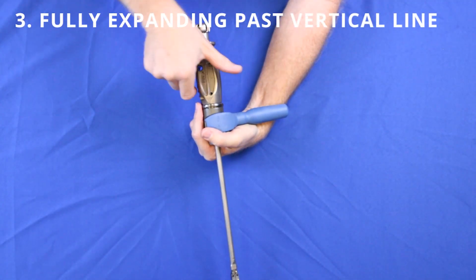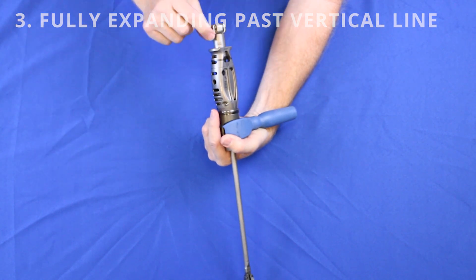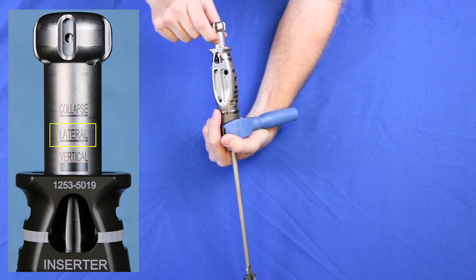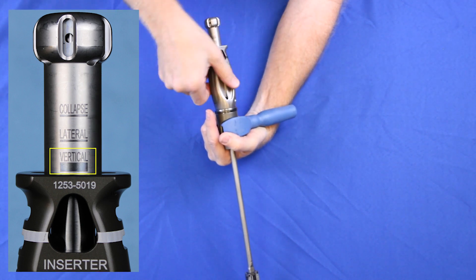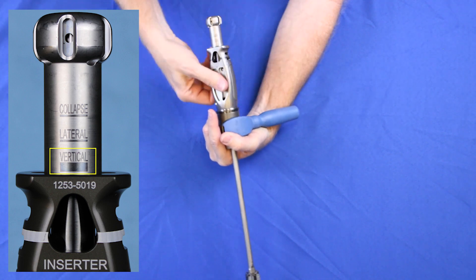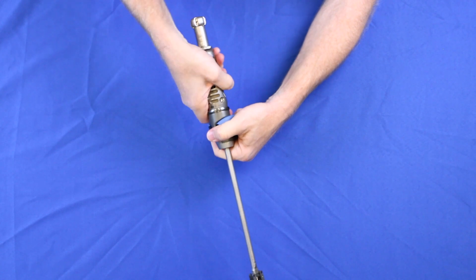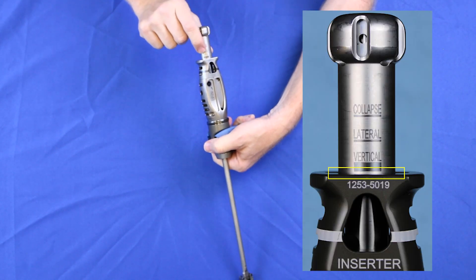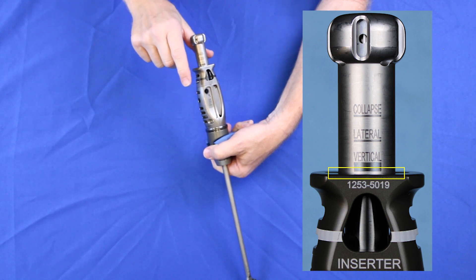When expanding the implant, turn the handle clockwise and the drawbar will show you collapsed to laterally expanded. If you continue going, you'll get to vertically expanded — it's a thick black line. Go beyond the thick black line. Make sure that the implant is fully expanded by ensuring that there is some silver below the thick black line that says vertical. That will get the implant fully expanded and ready for the lockout screw.